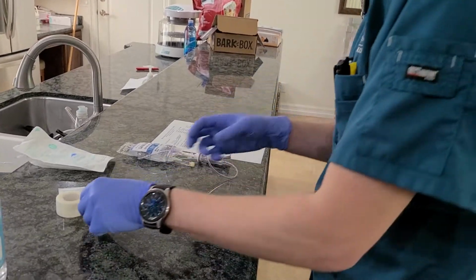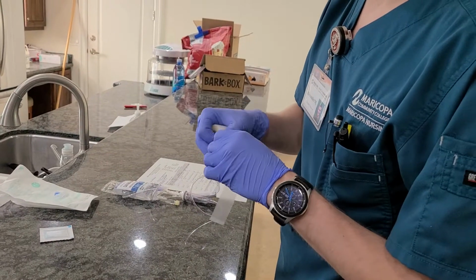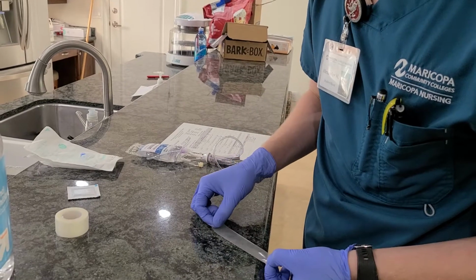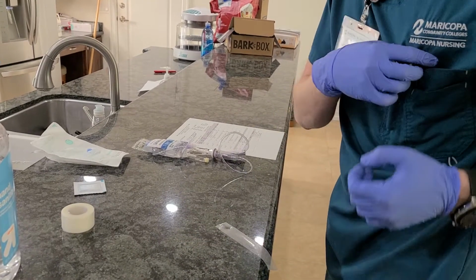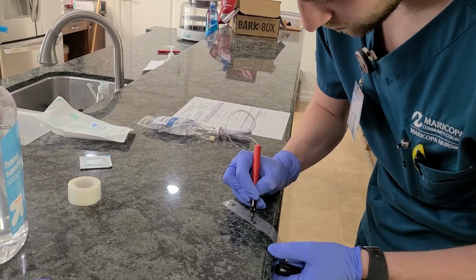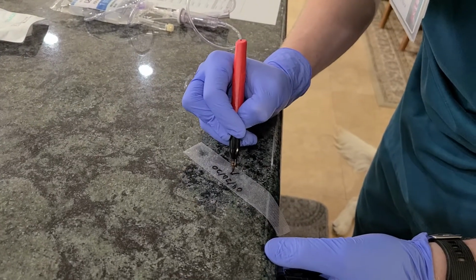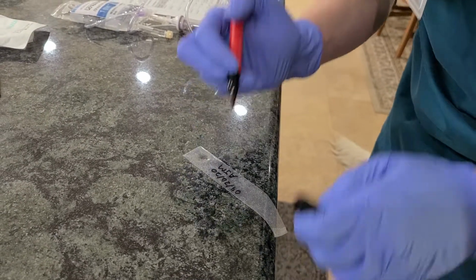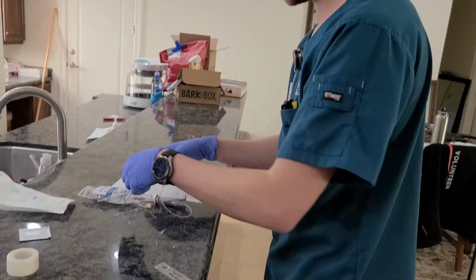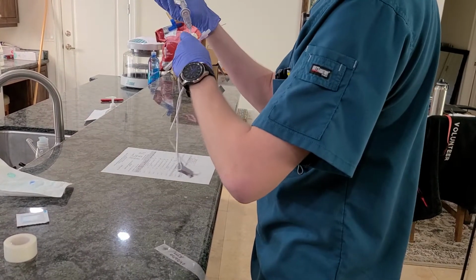Now I'm going to make my label for the med. We look at today's date, which is April 20th, 2020. Then I'm going to put my initials, which are A, J, M. Now that I made my label, I'm going to make sure that I attach it to my medication.